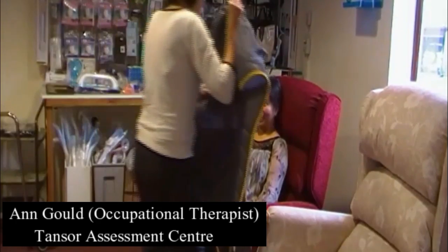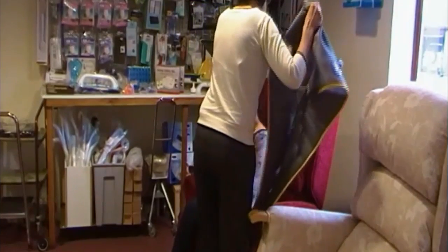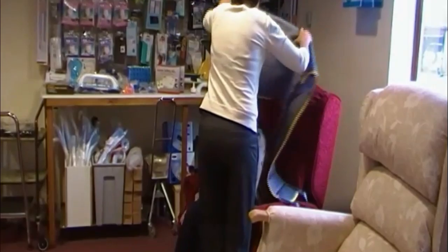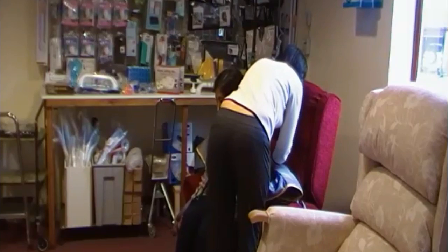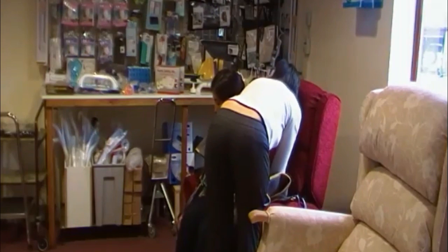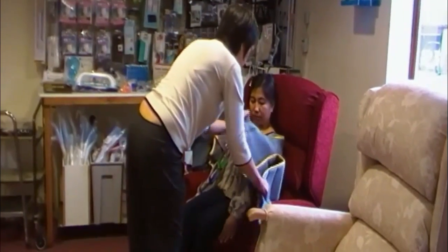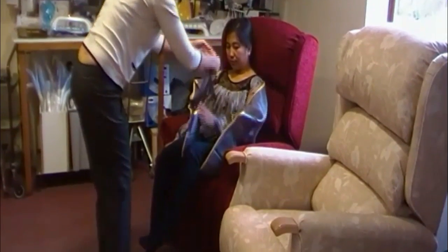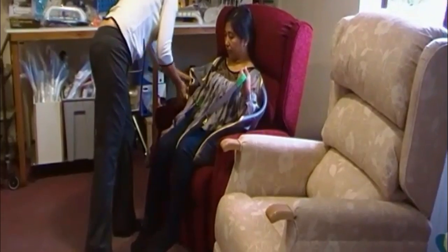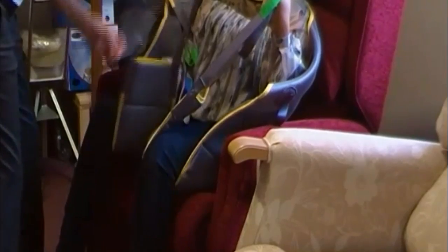Oh, hello. And we're just going to help you to lift you up and take you onto the bed, okay? So if you lean yourself forward, we'll put the sling on. You don't need to sit on it, that just needs to go down to touch the bottom of the chair. Now you can lean back, and we're going to pull this part through your legs. So we'll pull that one, you want to pull it through so you see the material. It's very easy to put it on you because you're quite flexible. There we are. We'll cross those.